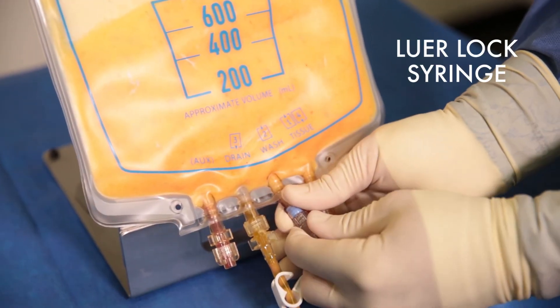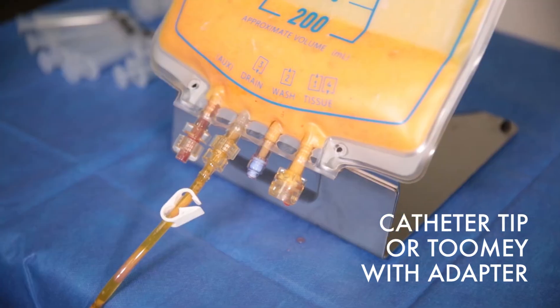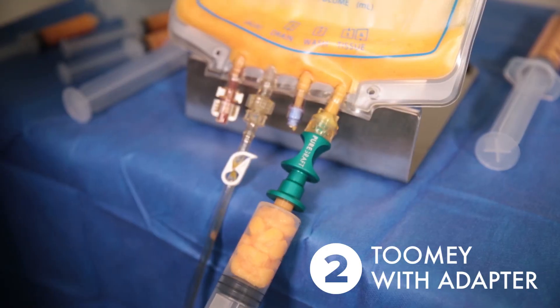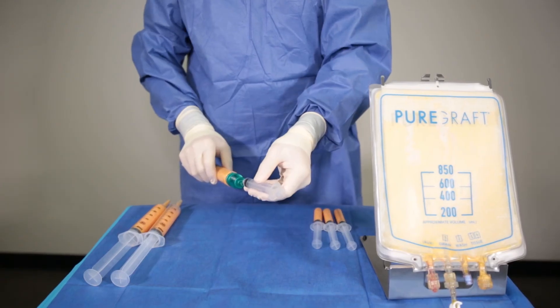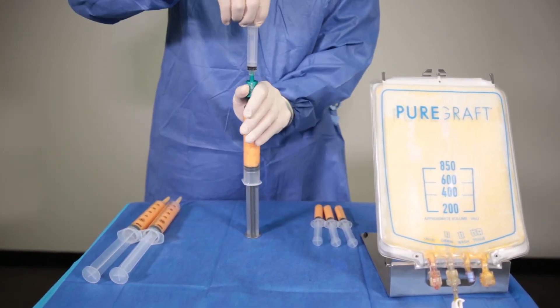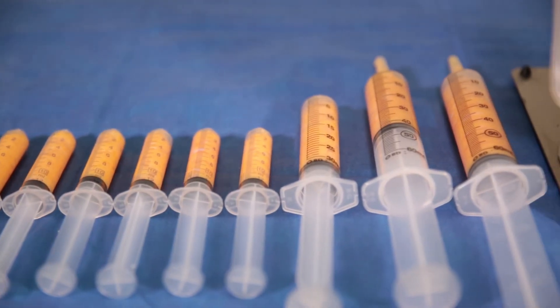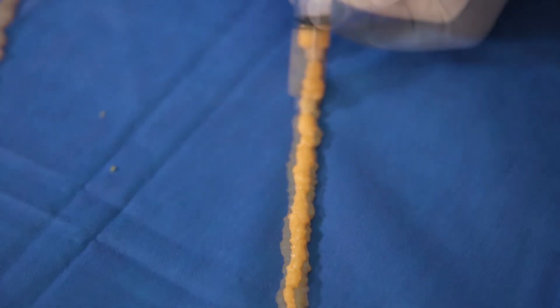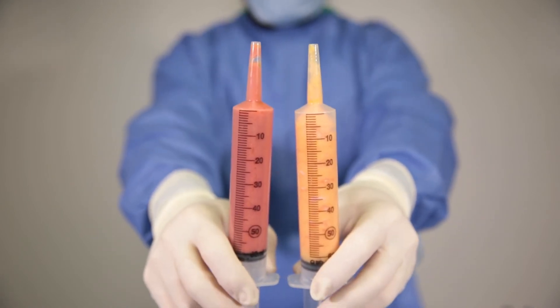To remove tissue from the bag, the wash and tissue ports may both be used, but utilizing the tissue port is the preferred method. Place the syringe in the tissue port and aspirate while pressing the tissue towards the port with the slider. If the surgeon desires to inject the fat with a LuerLock syringe, utilize the PureGraft adapter as shown to facilitate the transfer of tissue. After the case is complete, the disposable items can be thrown away and all seven reusable items can be sent to sterilization, making sure the silicone cap is not disposed.